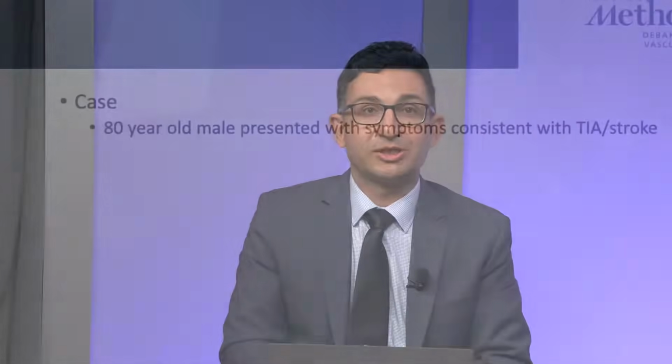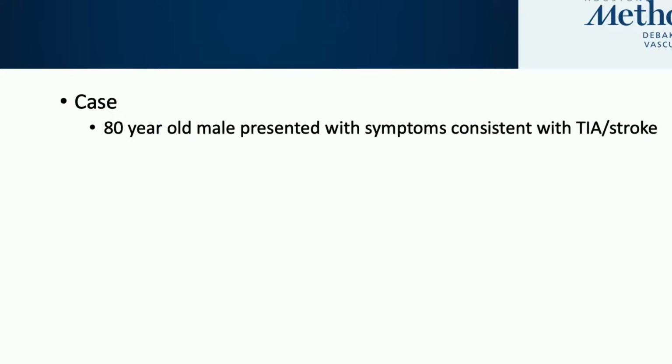Thank you. Good afternoon, everyone. Today I'm presenting a case of bioprosthetic aortic valve thrombosis and discussing the role of multimodality imaging. So we're going to start with the case. The case is an 80-year-old male that presented with symptoms consistent with TIA and stroke.